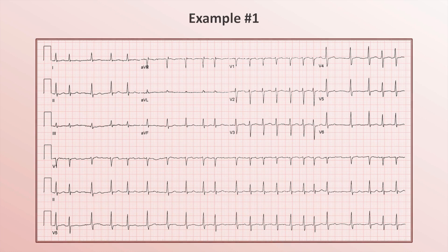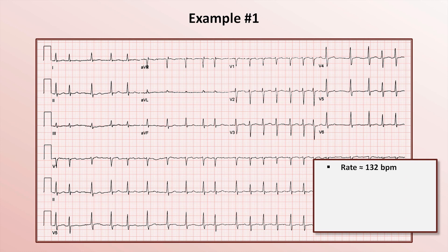Here's example 1. Using the 10-second rule, we can count 22 QRS complexes across the 10-second rhythm strip, which we then multiply by 6 to get a rate of about 132.